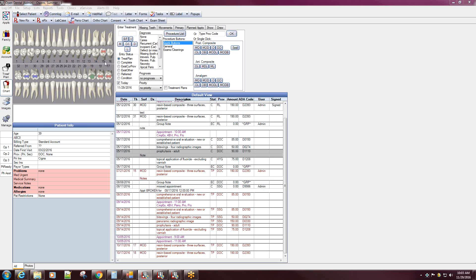The reason is because your 3D tooth chart graphics is set to simple tooth chart.